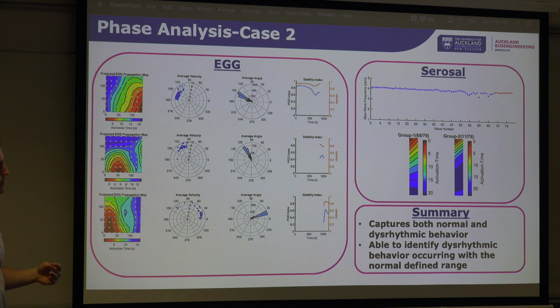So this method expands the clinical utility of the EGG, because not only can we tell the exact frequency, but we can also classify the directionality of that propagation within the normative range of EGG.